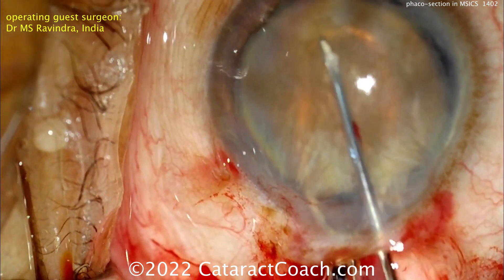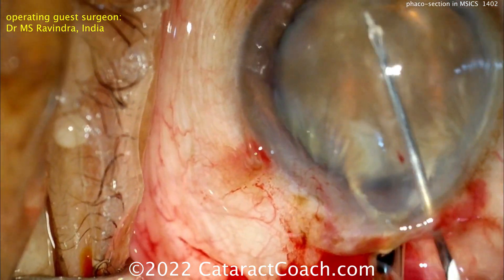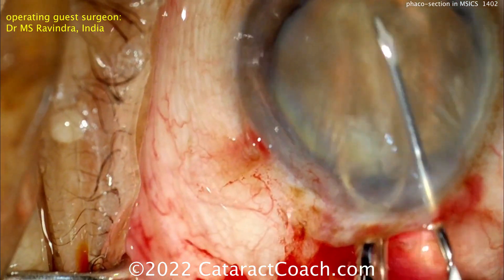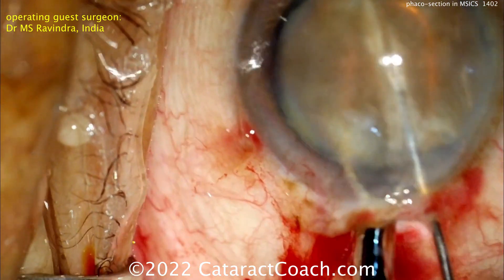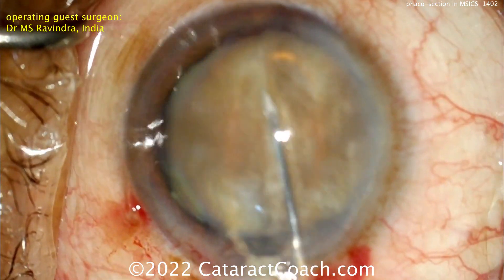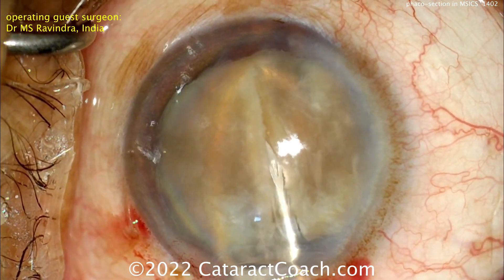Now using that same cystotome or a bent needle, the nucleus can be scored — repeatedly scored. The left hand holds the lens loop to secure the nucleus so it doesn't move around, while the right hand uses the cystotome or bent needle to keep scoring that nucleus, cutting down through it.